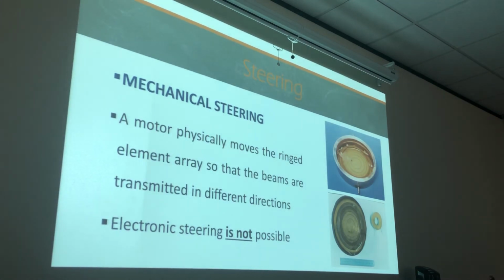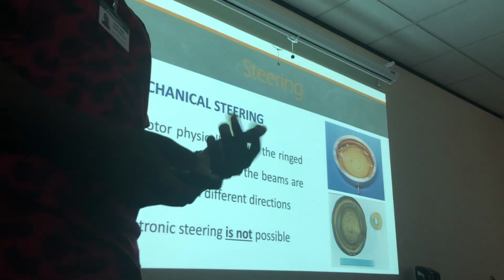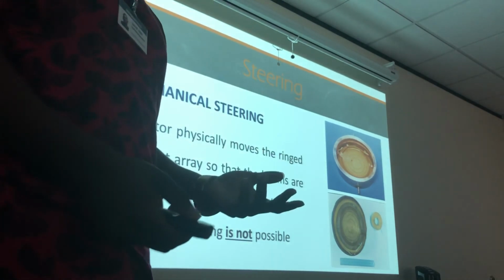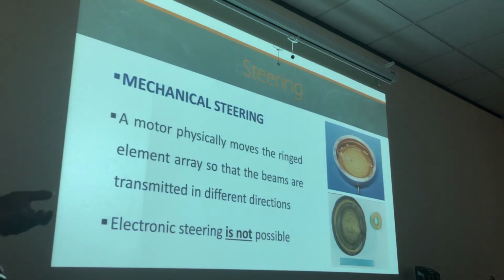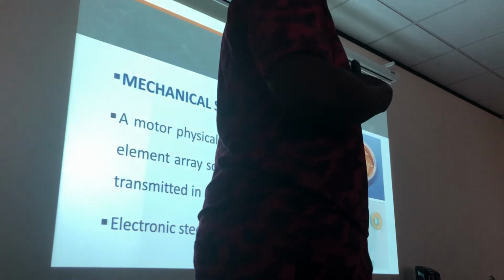Okay? How many crystals does it have? It varies. It does vary. I've heard them with 4 to 6 crystals, I would say. Okay. Electronic steering, guys, is not possible with this transducer. Same thing. Electronic steering is not possible with a mechanical transducer. The annular phased array and the mechanical are the only 2 transducers that have mechanical steering. All the other transducers we talk about are going to have electronic steering.